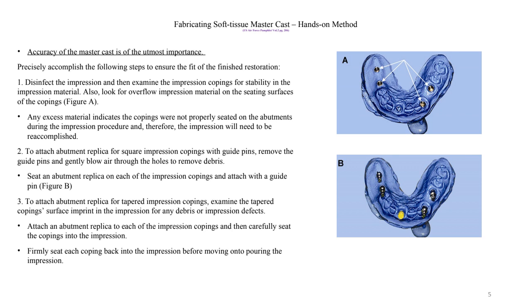To attach abutment replicas for square impression coppings with guide pins, remove the guide pins and gently blow air through the holes to remove debris. Seat an abutment replica on each impression coping and attach it with the guide pin. For tapered impression coppings, examine the tapered coping surface, inspect the impression for any debris or defects, attach an abutment replica to each impression coping, and carefully seat the copings back into the impression firmly before pouring up.